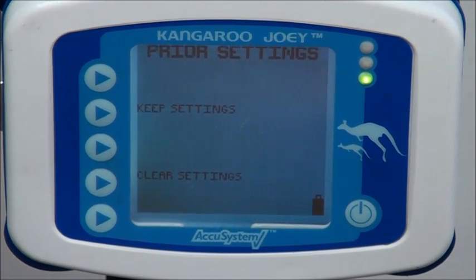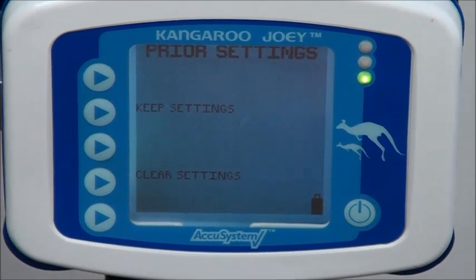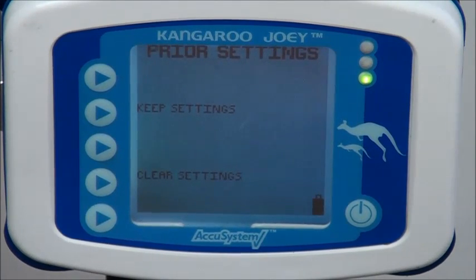It is going to tell you that you can either keep settings or clear settings. Each time you set up a new patient with the pump, you're going to want to clear settings so you can put in your prescribed settings from your doctor. Once you get this set up and you're going to be using it on the same patient day after day, you can go ahead and keep settings. But for demonstration purposes, we're going to go through and clear settings and show you how to set the pump.